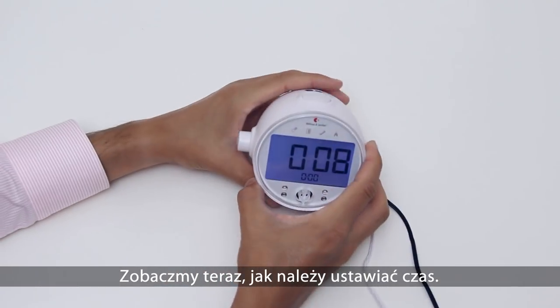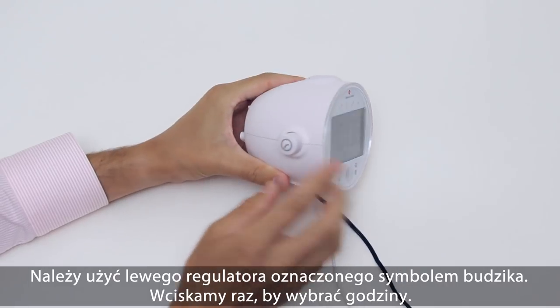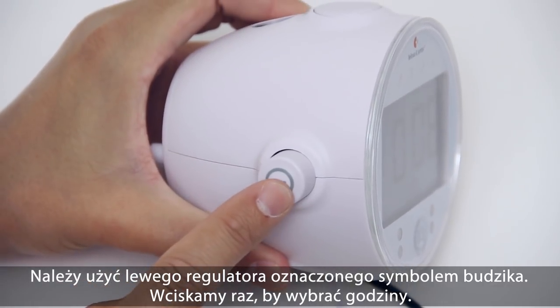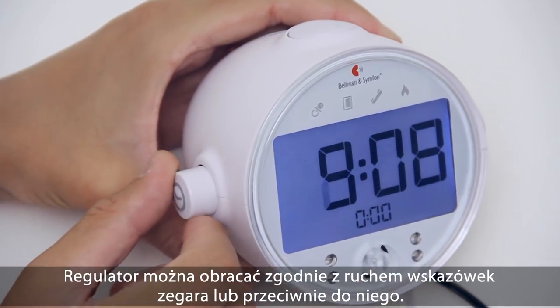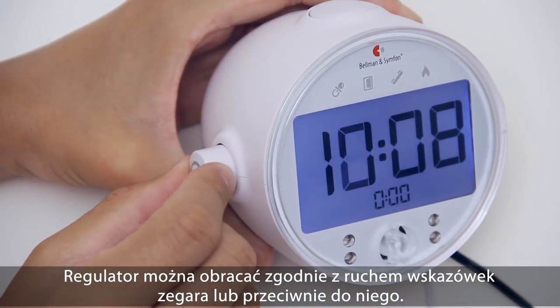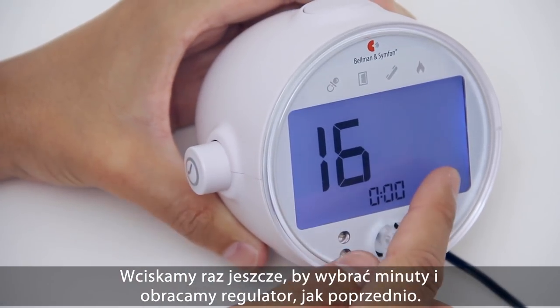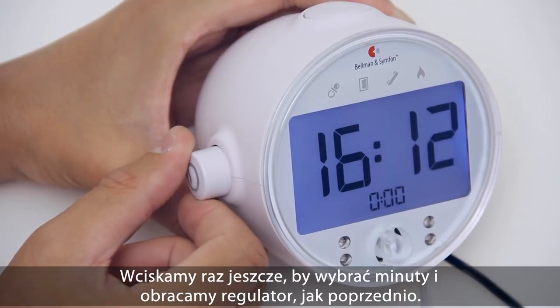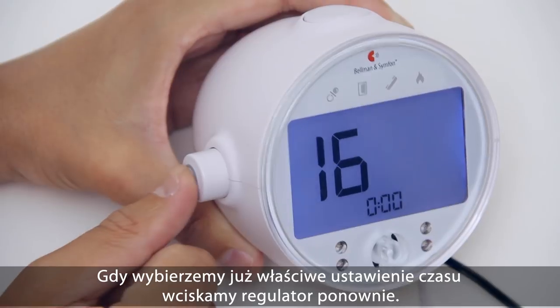Now let's have a look at how to set the time. Use the left knob, marked with a clock symbol. Press it once to select hours, then turn it both clockwise and counter-clockwise. Press it again to select minutes and turn the knob as before. When you are ready, press the knob one more time to exit the time setting.